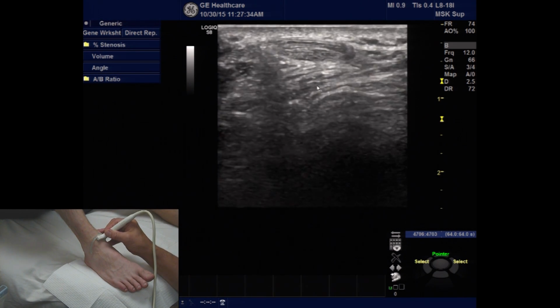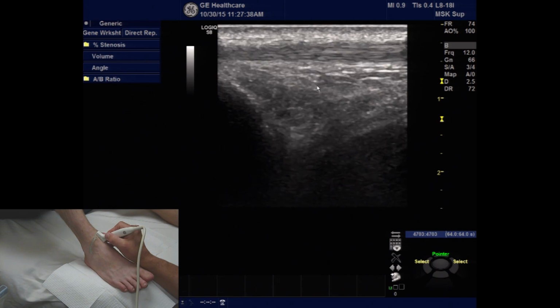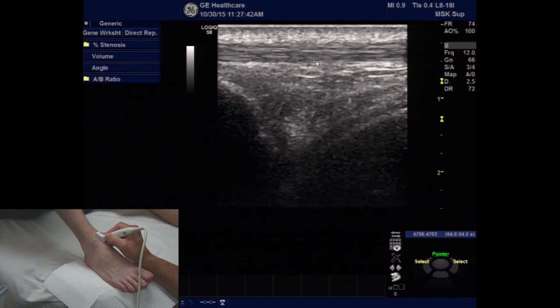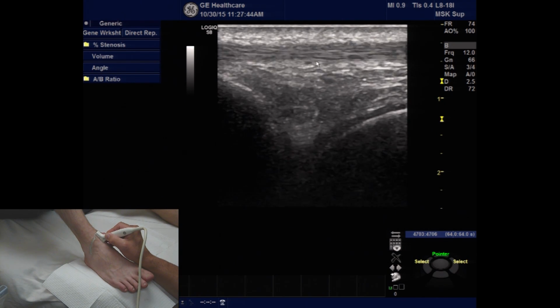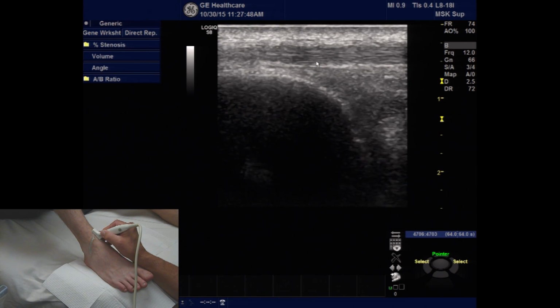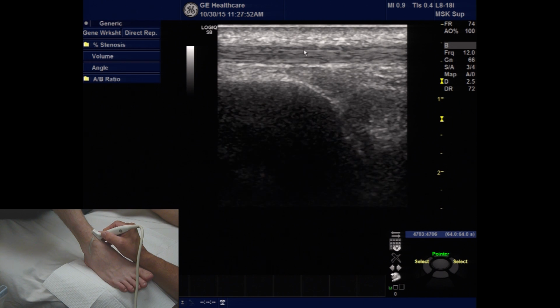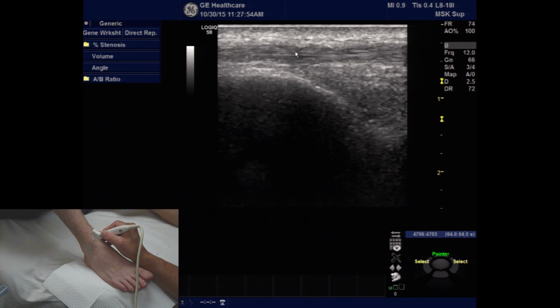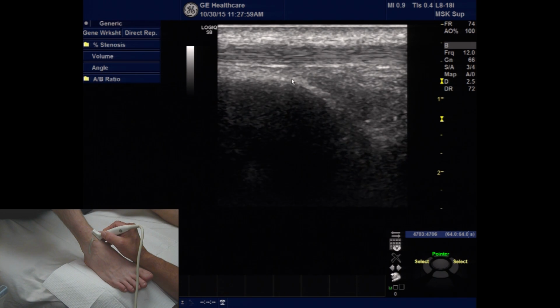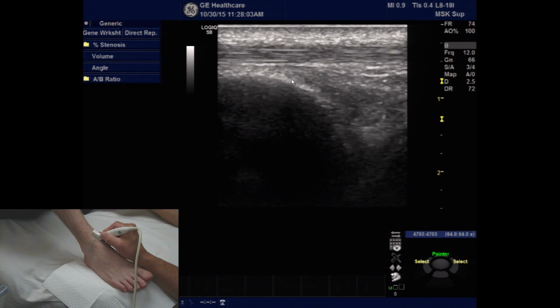Now we can turn the transducer 90 degrees clockwise, or an orthogonal plane, and then we'll see the same structure in its long axis. Important to remember is the bone landmarks that will help us determine where we are. The tibialis anterior fibers are going to run in a linear fashion when we're in long axis, and just deep to the tibialis anterior, we're going to see the distal tibia.